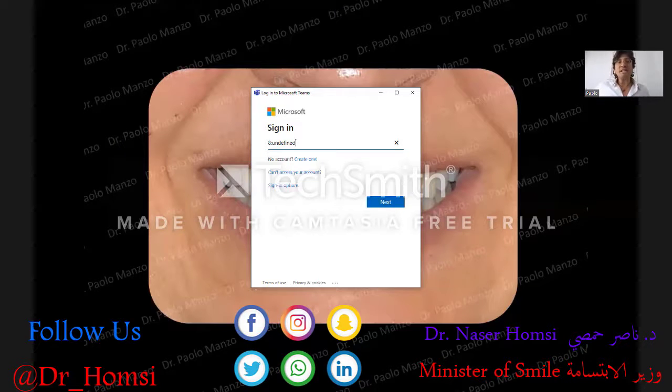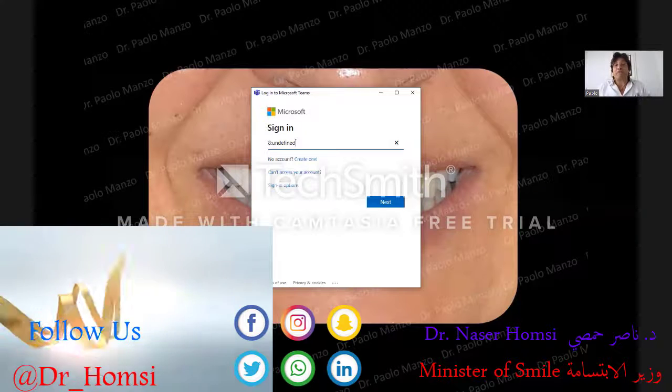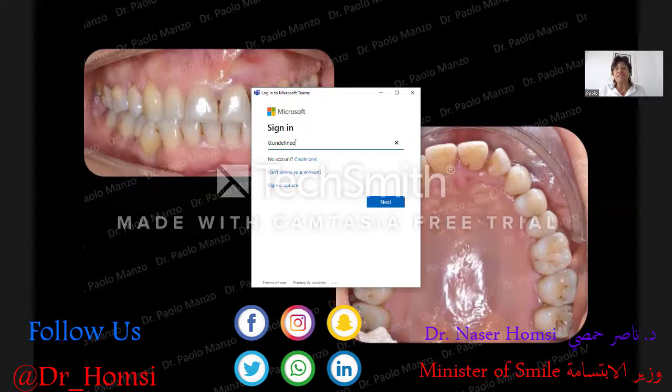And the last sequence to show you this targeted approach is dedicated to this lady. She's very famous in Italy because she makes some selection for singers, okay, on the television. And she asked me, doctor, I would ask you some aesthetic solution for this tooth because I received the treatment like 25 years ago, but this lateral incisor rotated again. So probably it's a kind of relapse of this lateral incisor. She was really scared about the prosthetic option, and I would like to propose her something invisible.